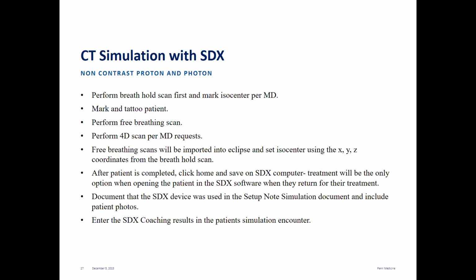After the patient is completed, this is just to reiterate that you want to make sure that you click home and save on the SDX computer. This makes treatment the only option when the patient comes back for their treatments on a daily basis.